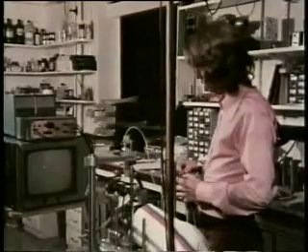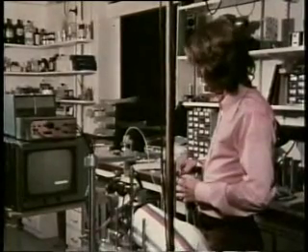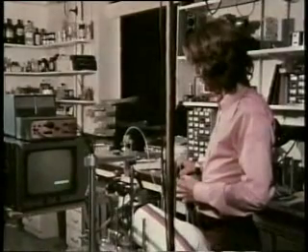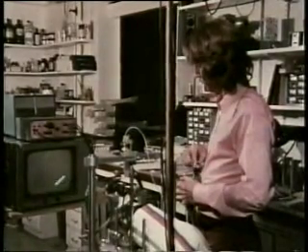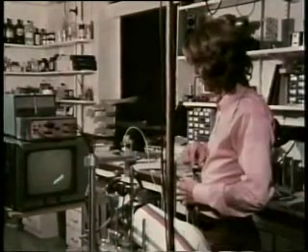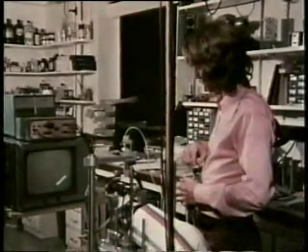So now, let's use patterns of light on a television screen in front of the cat to try to define the cell's receptive field. This is a so-called simple cell.